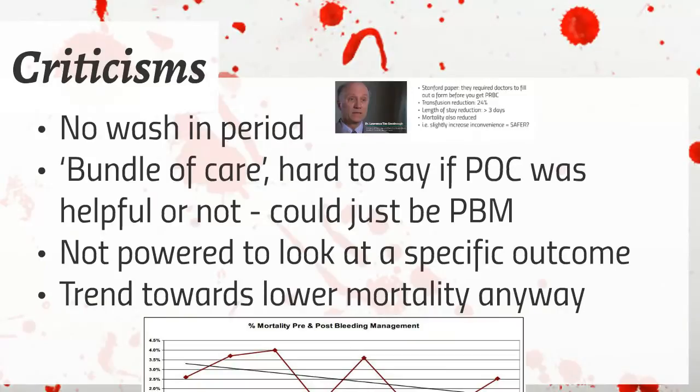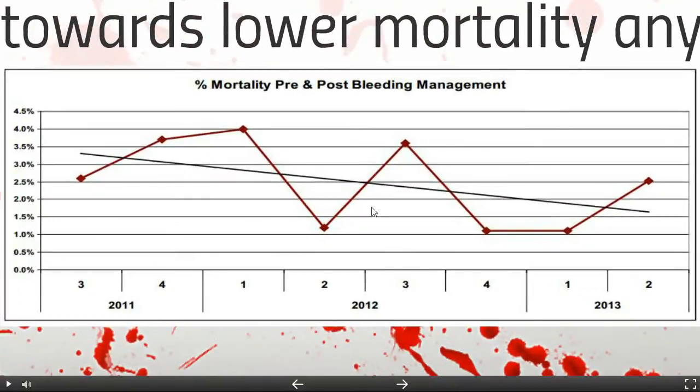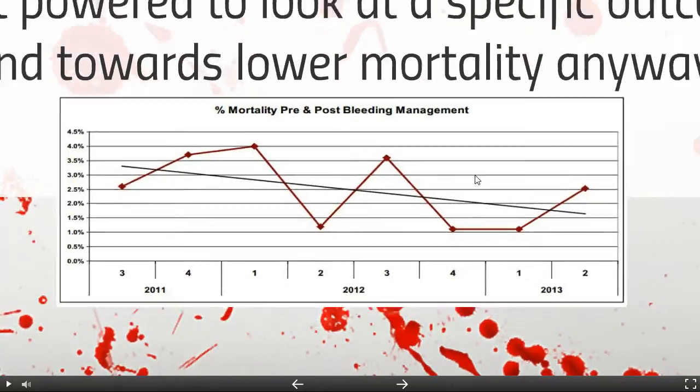It's pretty amazing. This MBA study wasn't powered to look at any specific outcome either, and there was a trend towards lower mortality anyway. You can see this is the introduction in the middle here, and it was kind of trending down anyway.